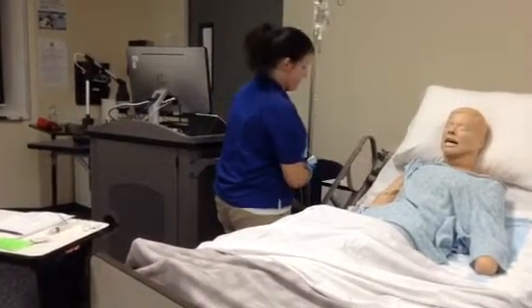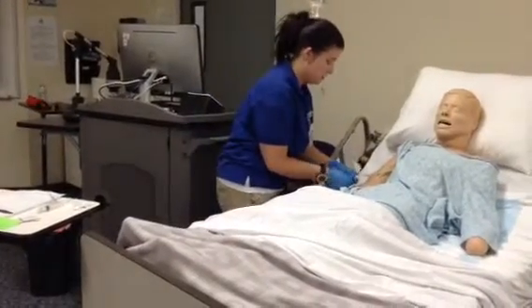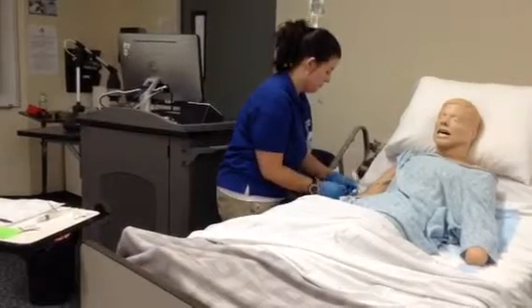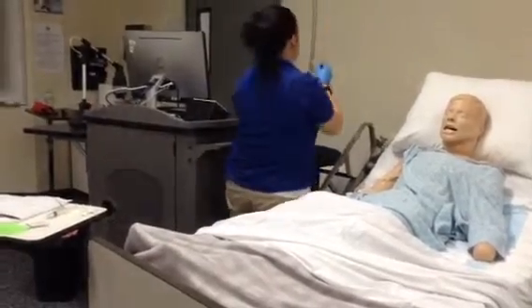Clamp this off. Alright, unhook this medication.